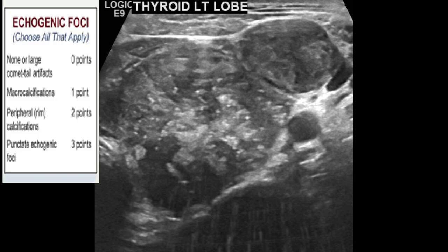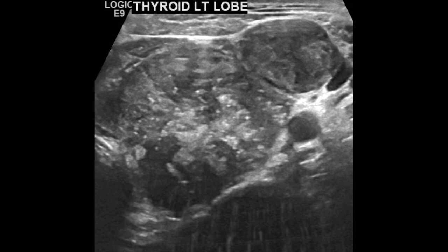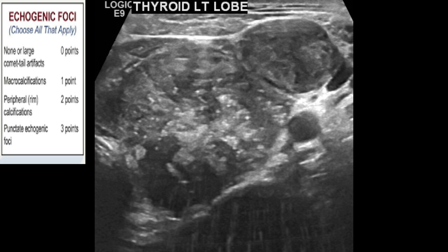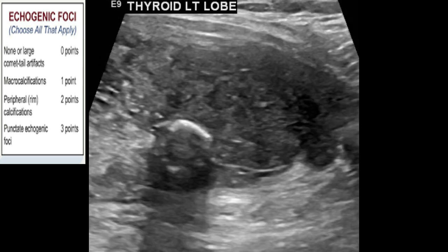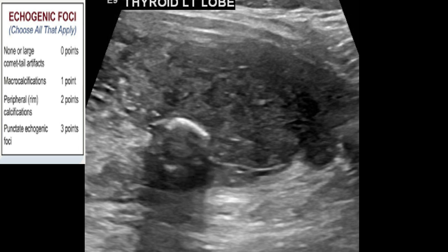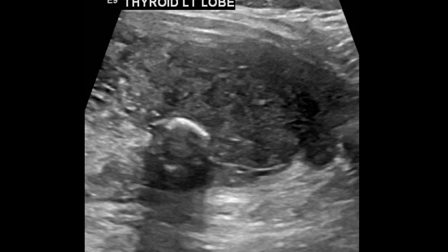The last category is echogenic foci. Always remember that the nodule itself can have two types of echogenic foci. In this case, we have punctate echogenic foci and we will give it three points for that.